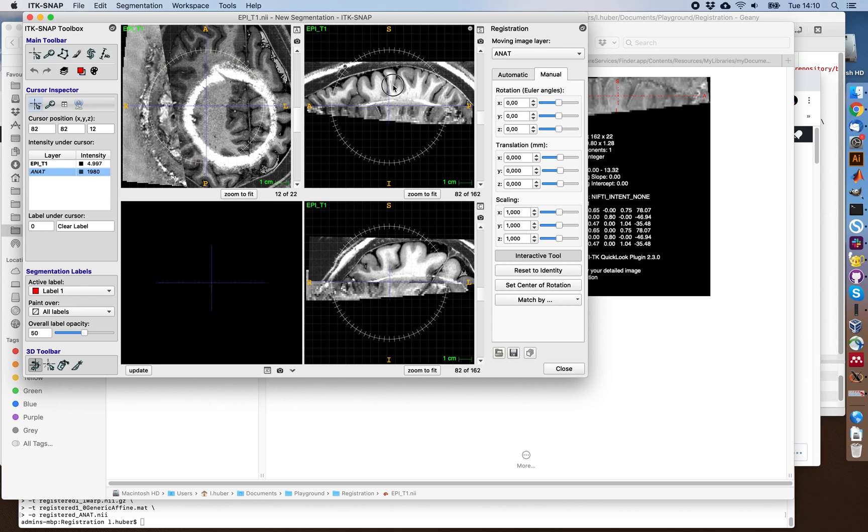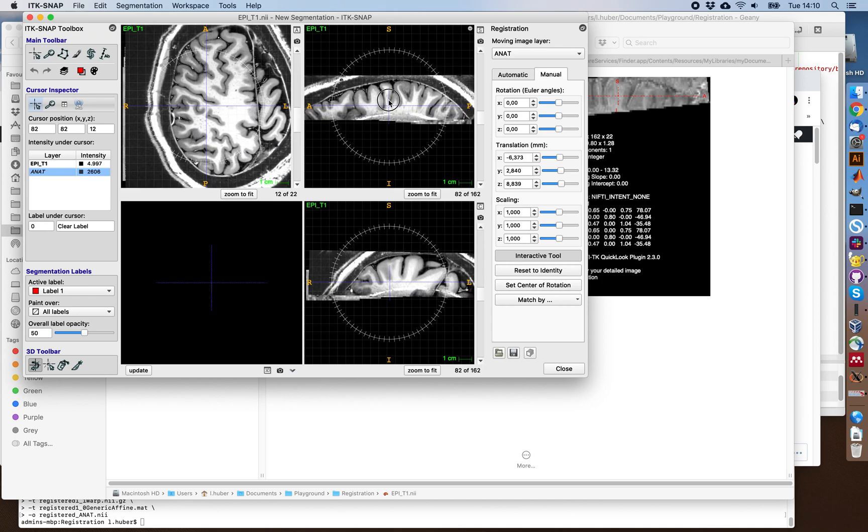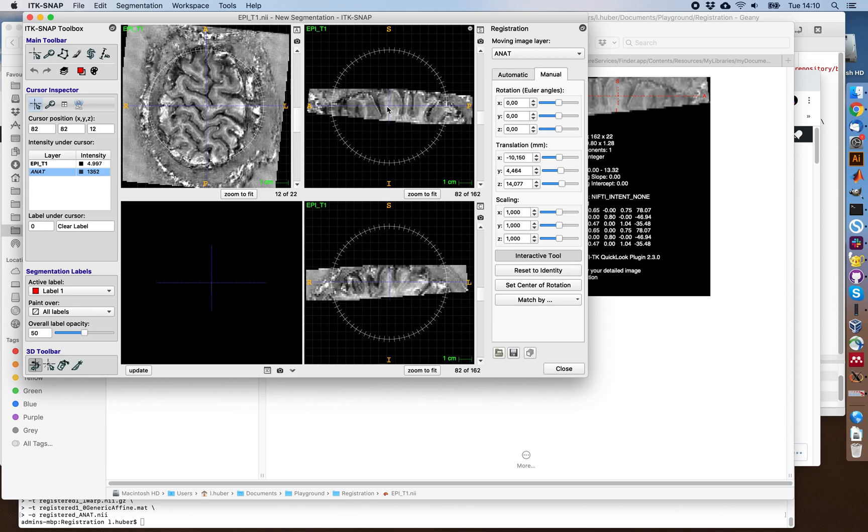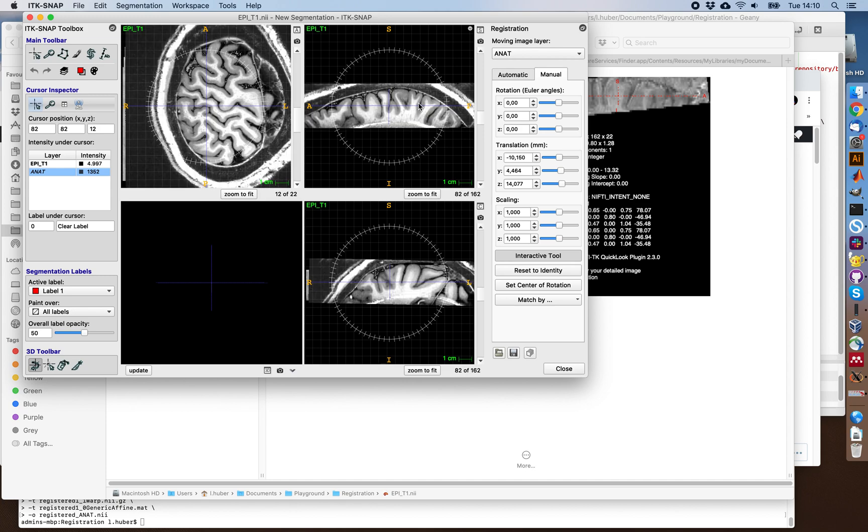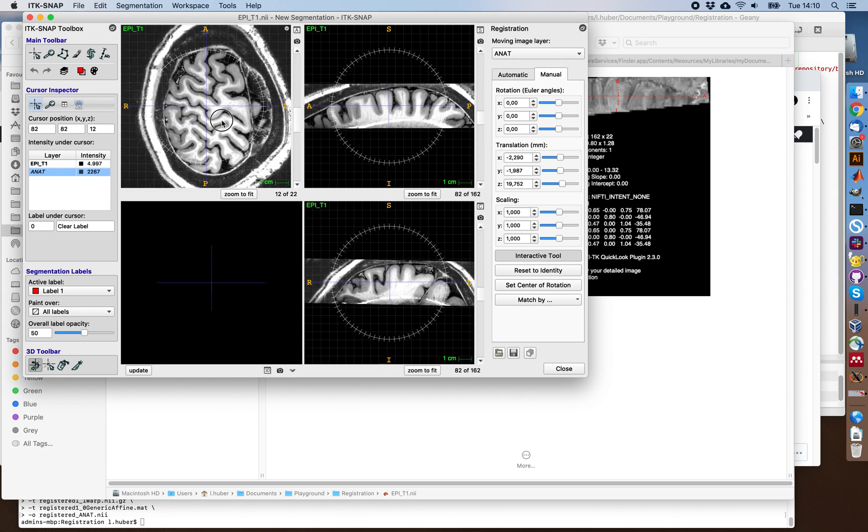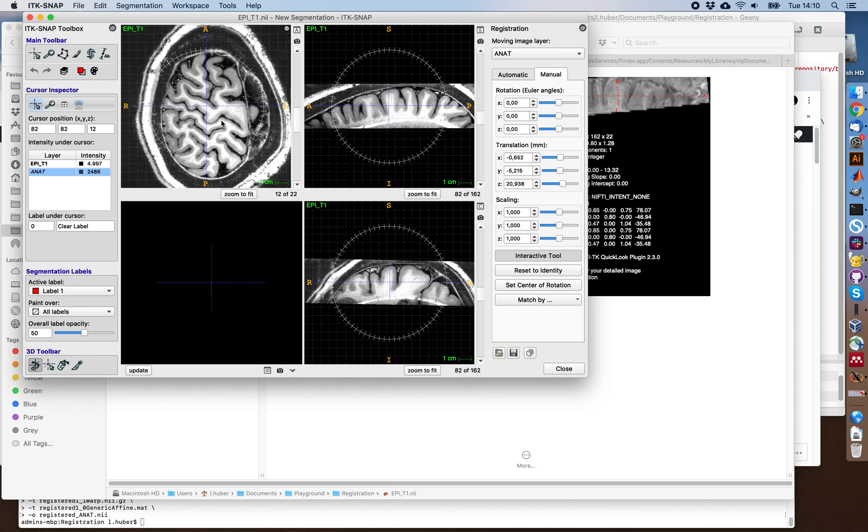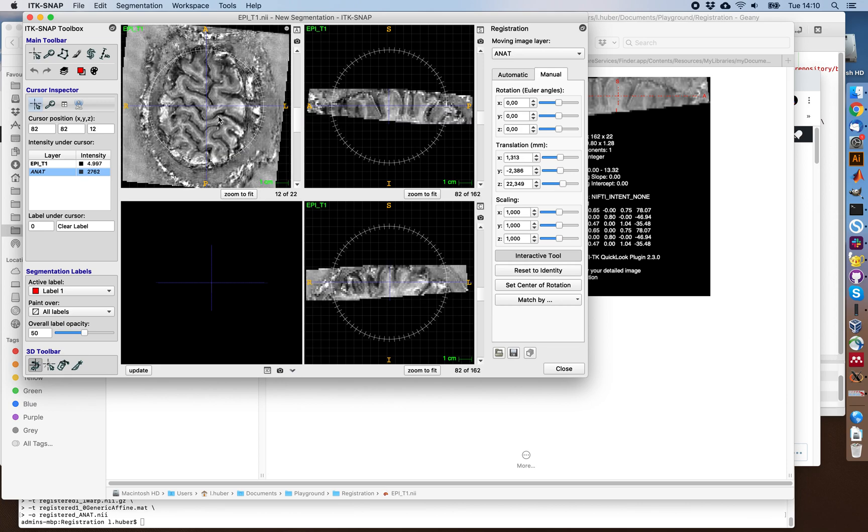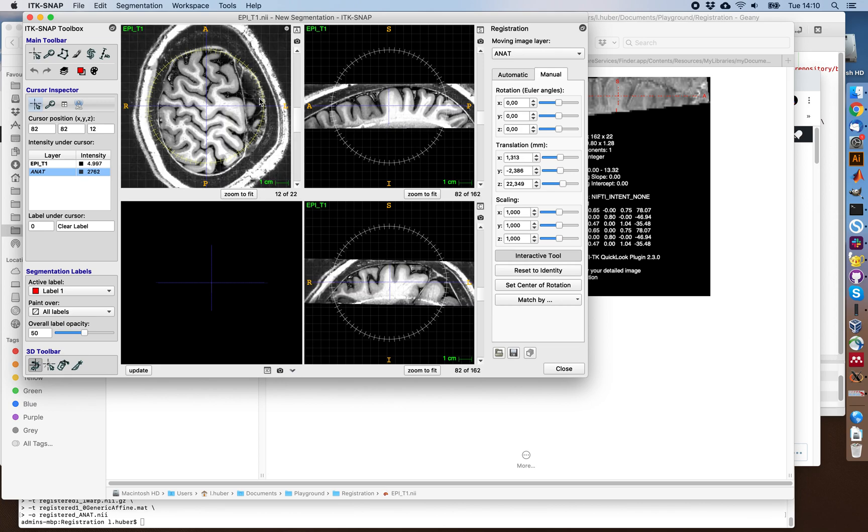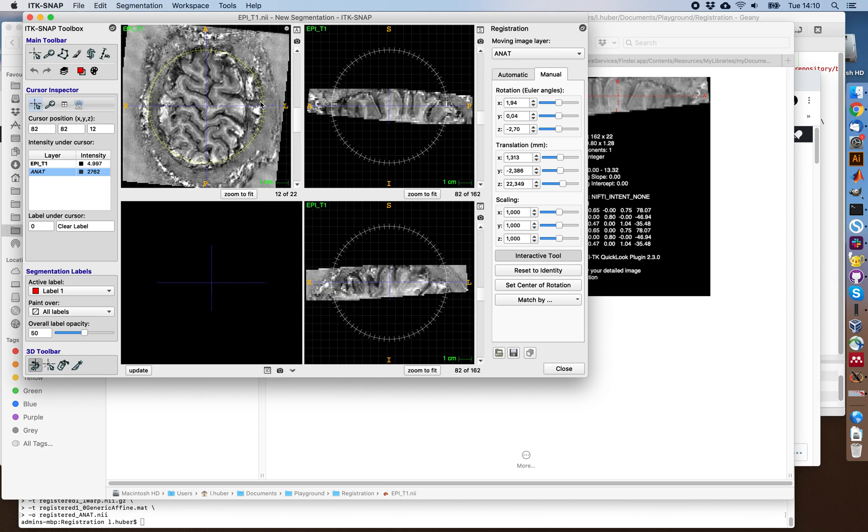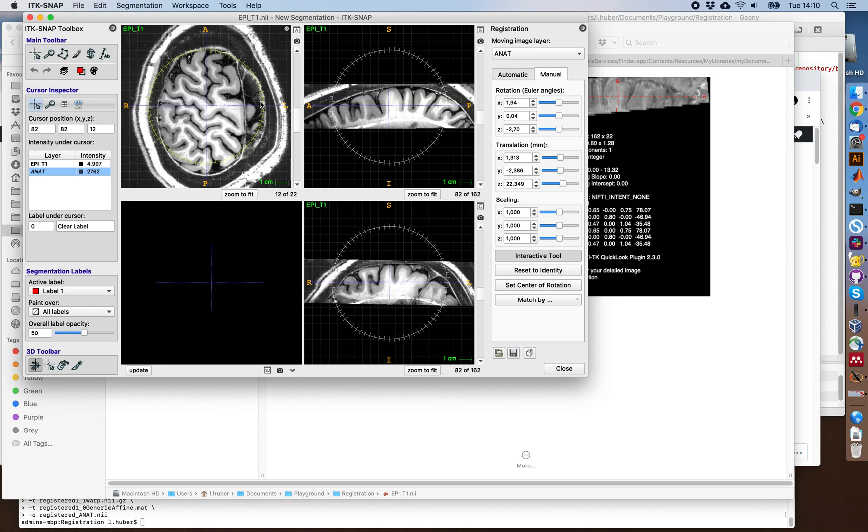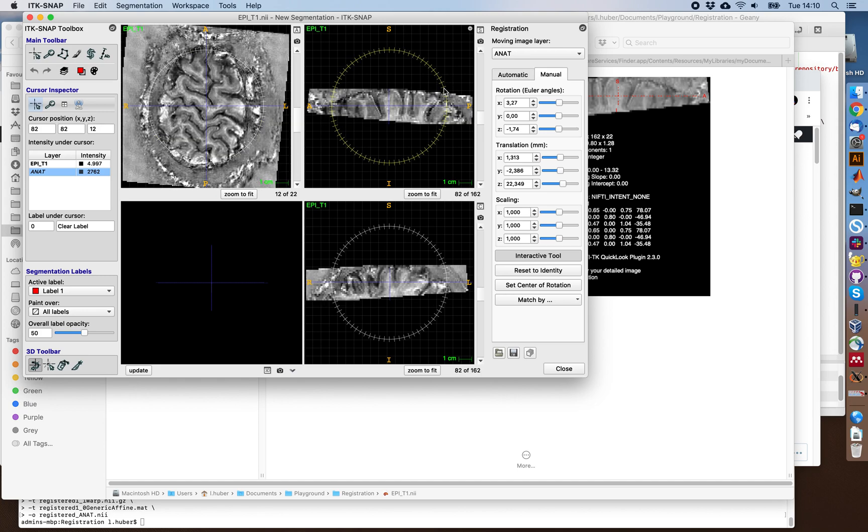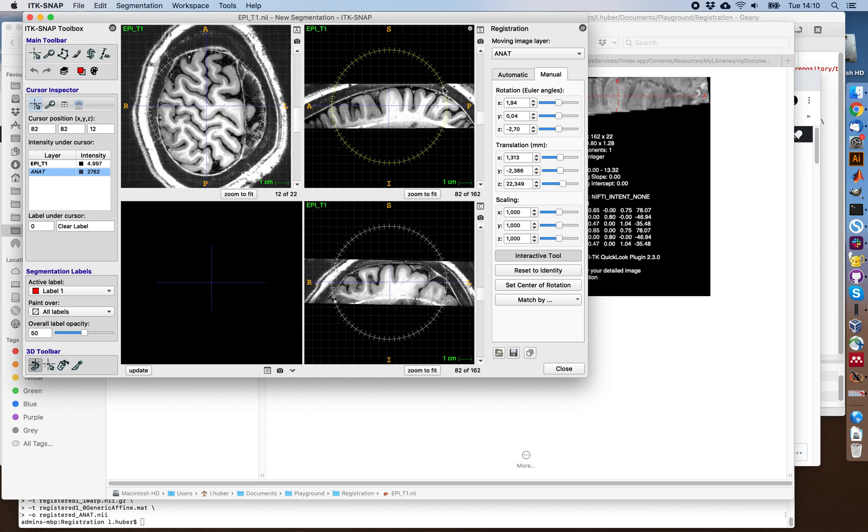So here you can select the overlay and manually adjust it while repeatedly pressing the W key to align them on top of each other. For example, like this, we're getting closer. You can rotate it. You might even have some angle here.